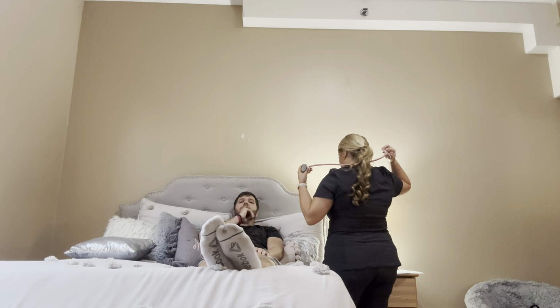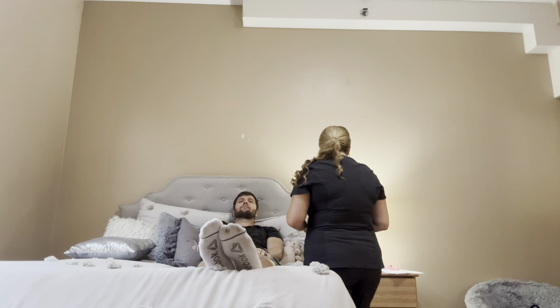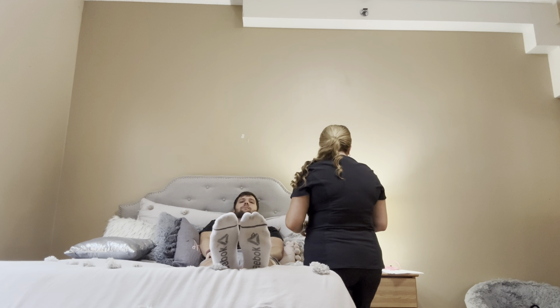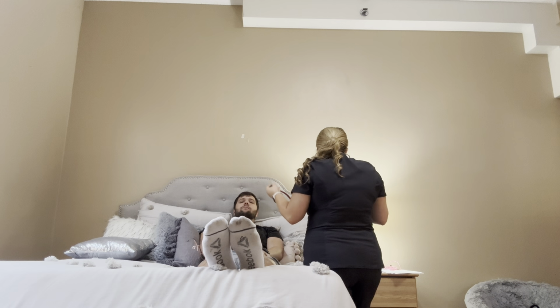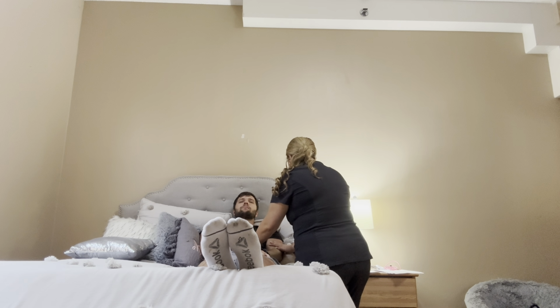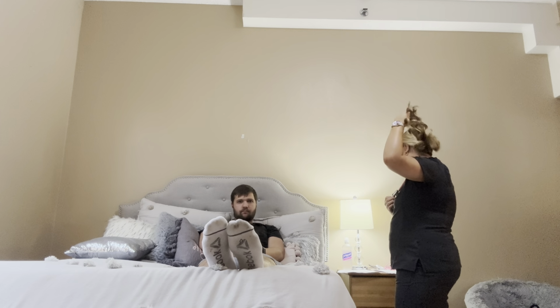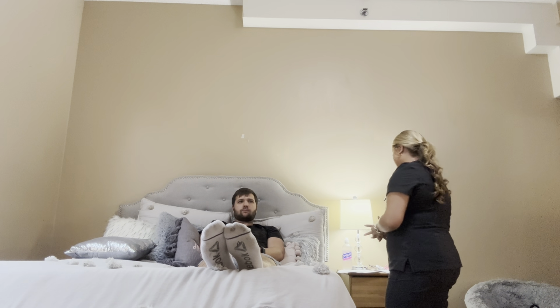I'm now going to use my stethoscope, Logan, to listen to your apical pulse for 1 full minute, okay? All right. And I am going to palpate and auscultate with the diaphragm of my stethoscope and then the bell. Alright, now that it's been a full minute, I have found that Logan's apical pulse rate is 72 and the rhythm is regular with no extra sounds or murmurs or anything like that.